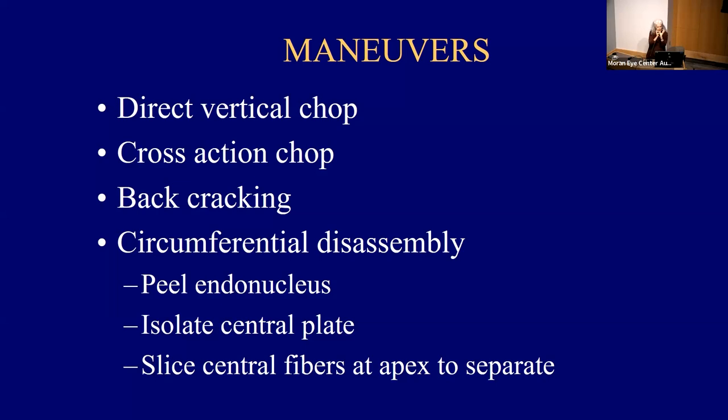You know, as you kind of eat a piece, sometimes you lose the depth of it right up here, and then you're at risk for getting the capsule or even worse, the iris, and not being able to get it to fall in. So if you have any crack, you can make it fall in. So let's look at that.